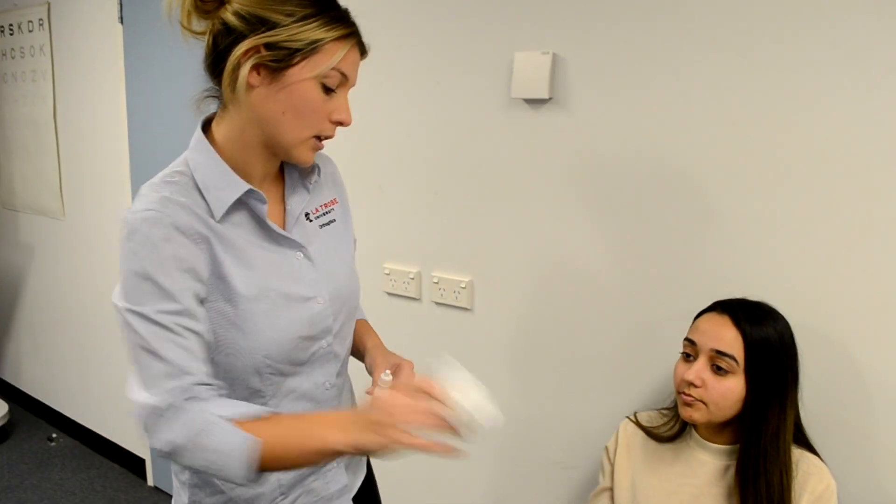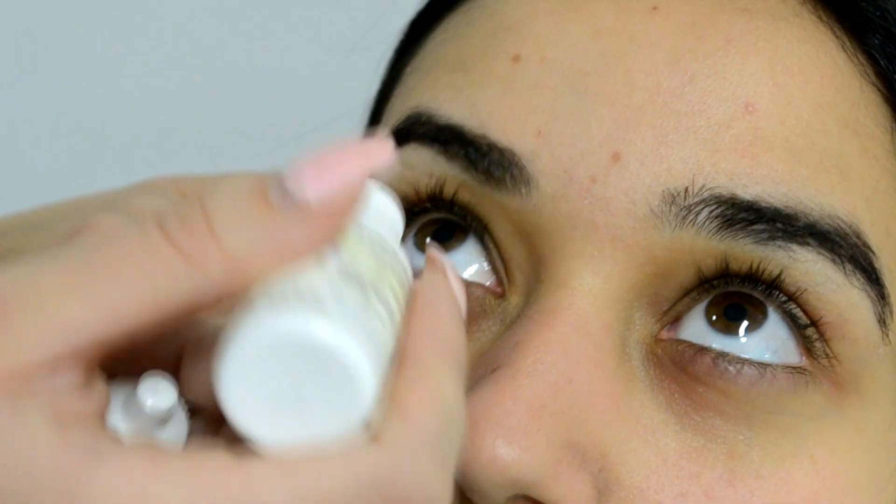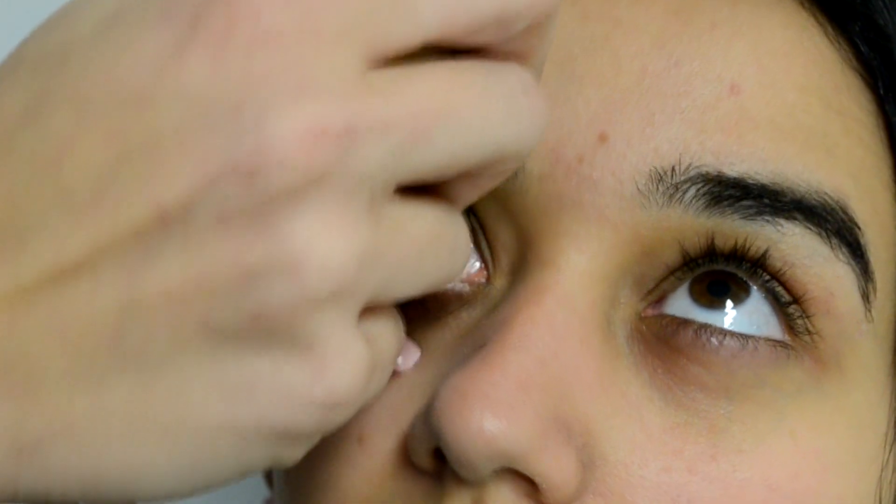As the pachymeter will be touching the cornea of the patient, anaesthetic will need to be instilled in the patient's eyes. For hygiene purposes, ensure that the cap of the alcaine is held and not placed on the table. "Okay, so now we're going to be putting the numbing drops into your eye. Remember they are going to sting a little bit. I'll give you a tissue — just hold that and I'll put them in, you can just dab your eye. I'll get you to look up for me." The drops are then instilled and the patient is invited to dab their eye with the tissue.